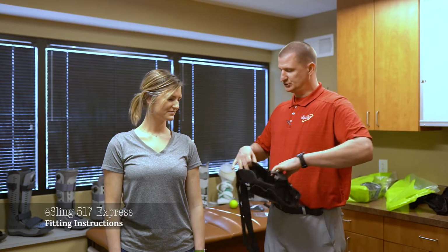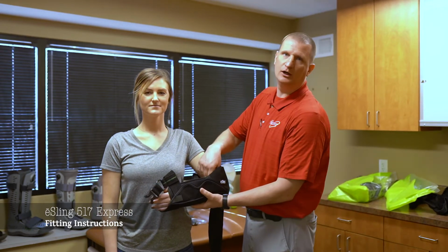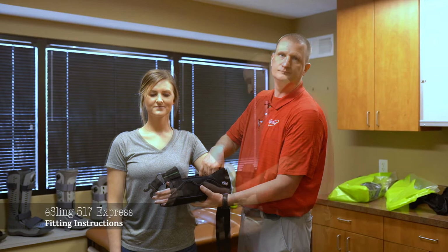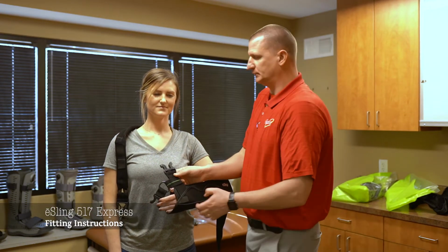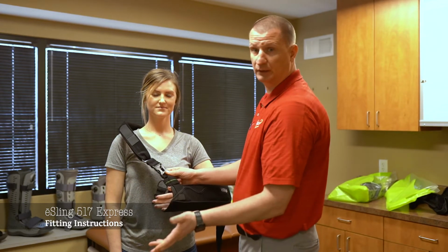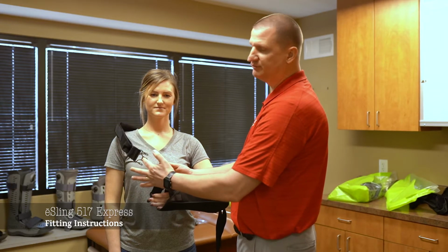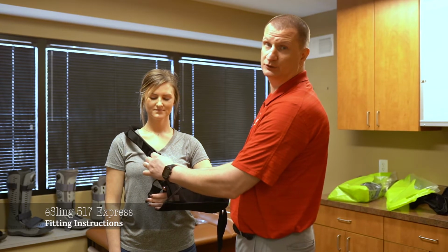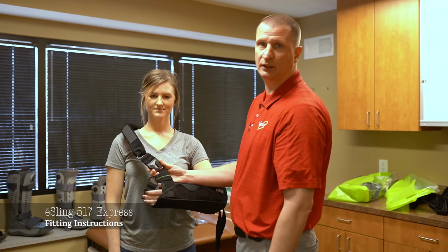Okay, she's just going to slide her arm into the sling. Okay, positioning the elbow all the way back in the cradle. Next thing we're going to do is bring over the crossbody strap and click it into the clip. Okay? This can be done with a single finger. Okay, so for example, if the patient is by themselves and doesn't have someone to help them after surgery, they could just clip it in like that.